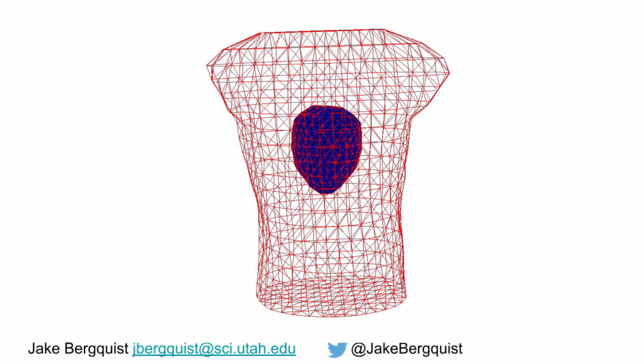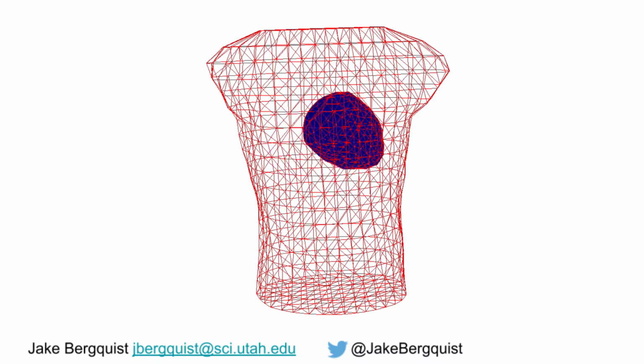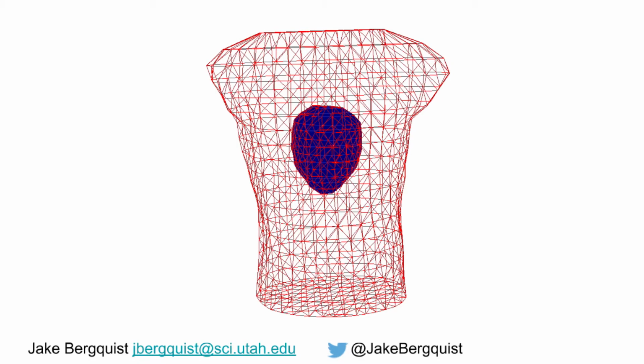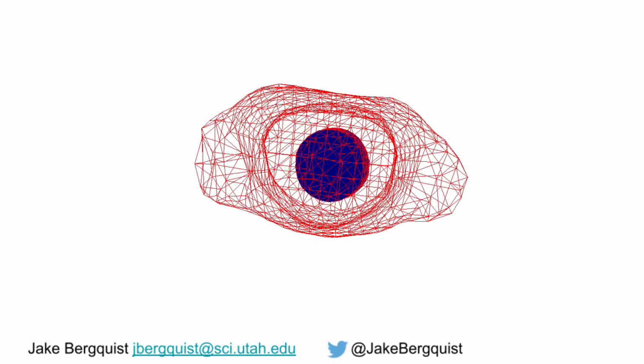We can describe the position of the heart using 6 degrees of freedom: pitch, yaw, roll, X translation, Y translation, and Z translation. Here, roll is defined along a septal axis. Let's watch all of those again from a different perspective. Pitch, yaw, roll, X, Y, Z.